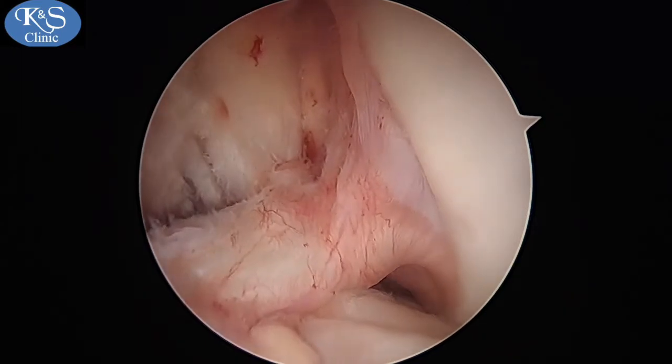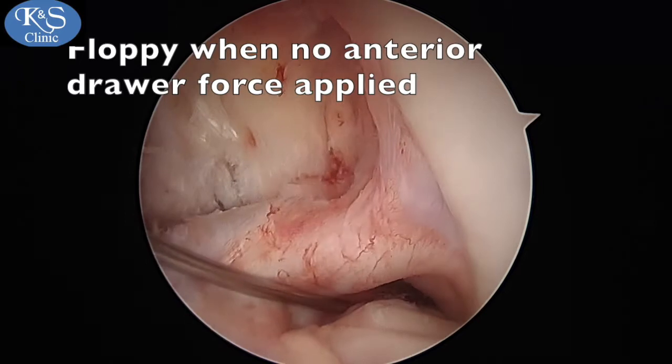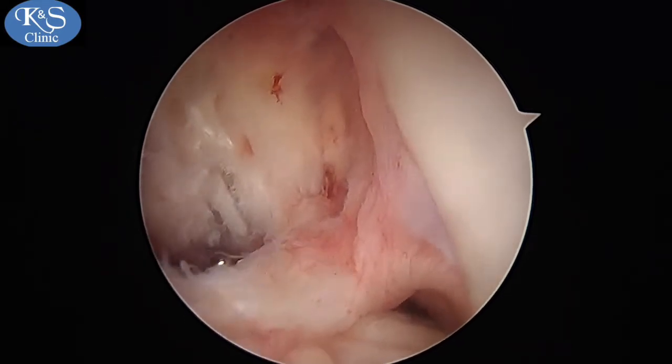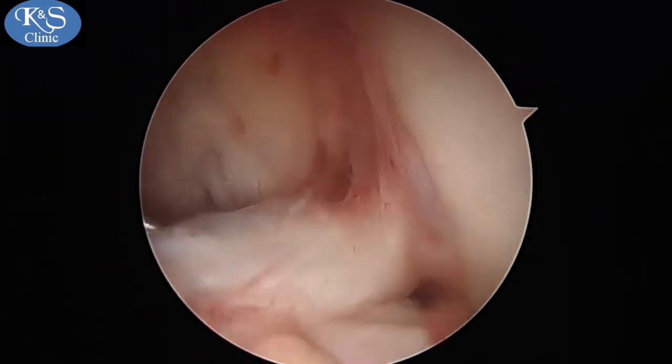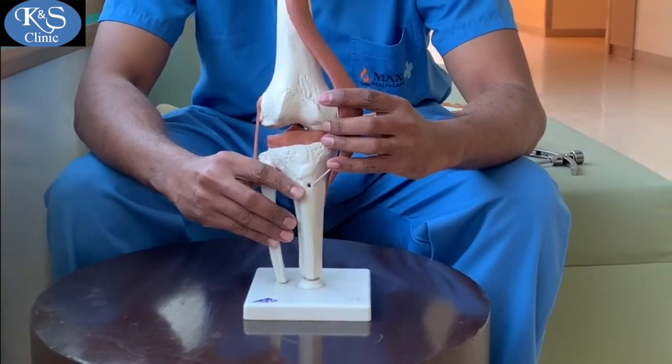When you do an anterior draw force, the ACL can be seen getting taut on the arthroscopic image, indicating that it is a floppy but not torn ACL because of the PCL tear. Here you can see it quite taut on an anterior draw test when probed.